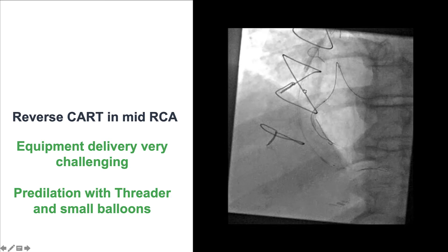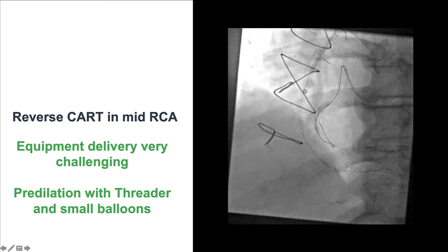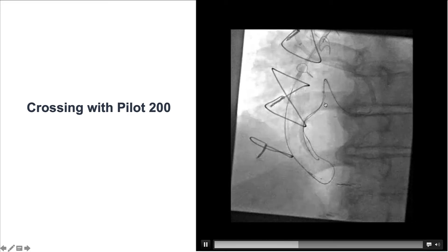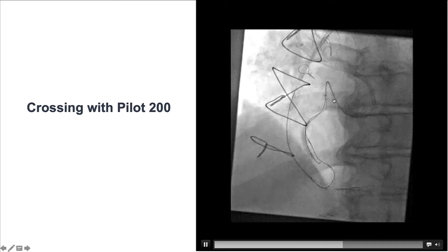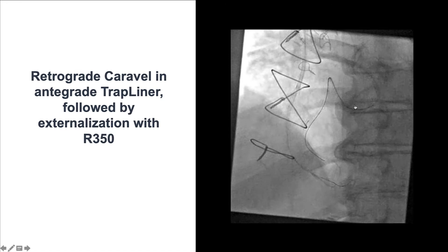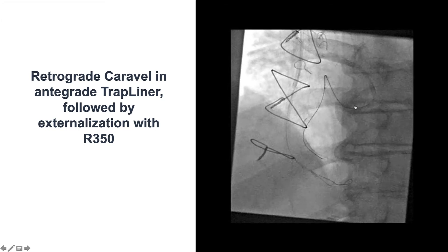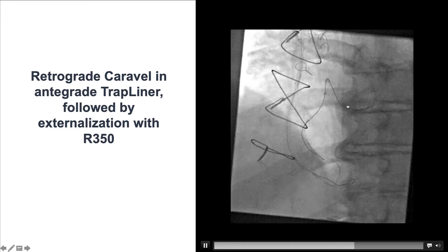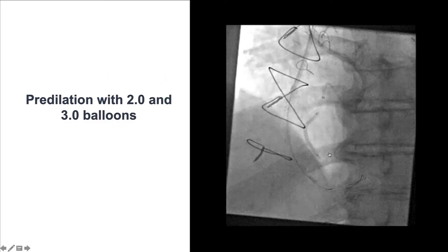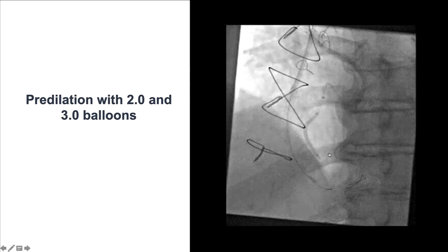Eventually we performed the reverse CART technique in the mid-right coronary artery. Getting equipment there was extremely challenging, requiring predilatation with multiple small balloons. Using an antegrade guide extension, we were able to advance a retrograde Pilot 200 guide wire into the antegrade guide extension. The Caraval was then inserted, and an R350 guide wire was successfully externalized. This proved critical for the success of the case, as support was very challenging through this highly tortuous and calcified RCA — without an externalized guide wire, we might not have been able to deliver equipment and stent the lesion.